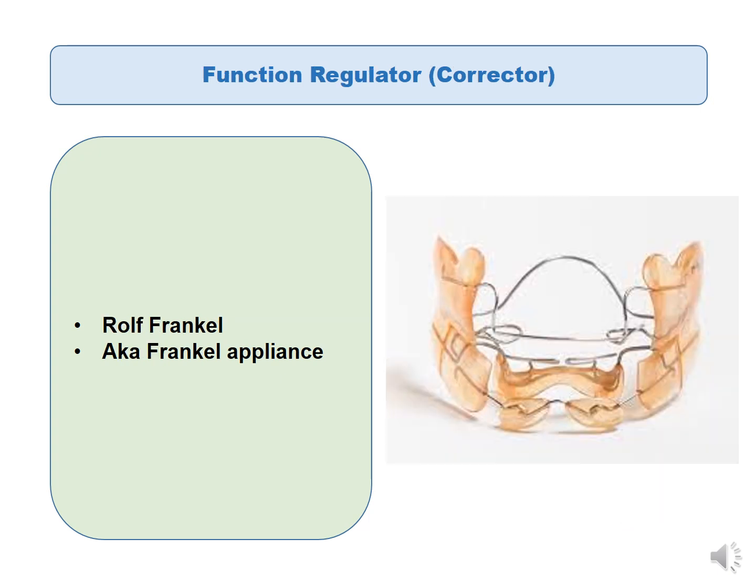Now let's have a look at the function regulator, also known as the function corrector. This was introduced by Rolf Fränkel, and thus it's also known as the Fränkel appliance.